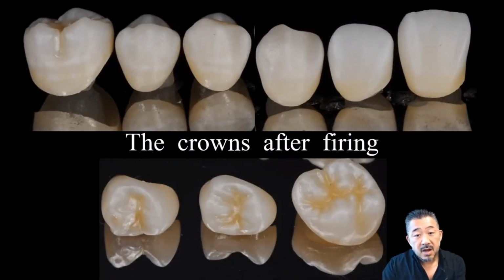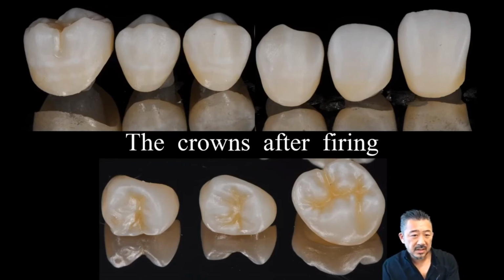Okay, these are the crowns after firing. As you can see, there's a gradation, and the marginal ridges and the white bands are also reproduced. What I keep in mind is that I don't reproduce 100% of the tone I want with the sintering stain, you know.